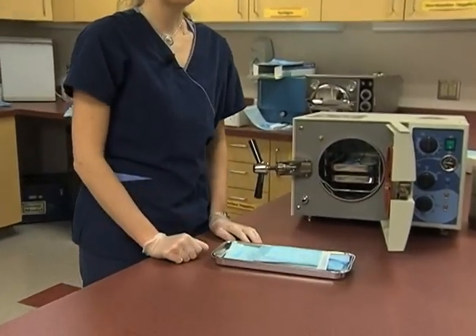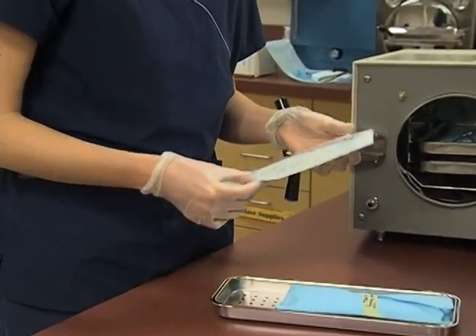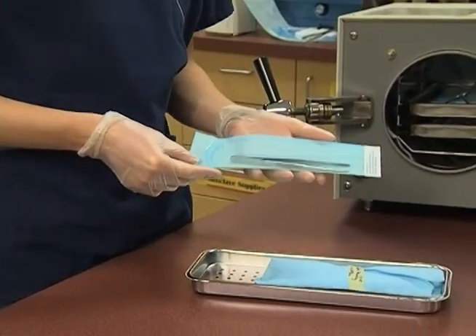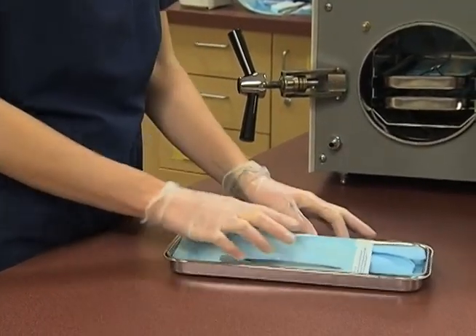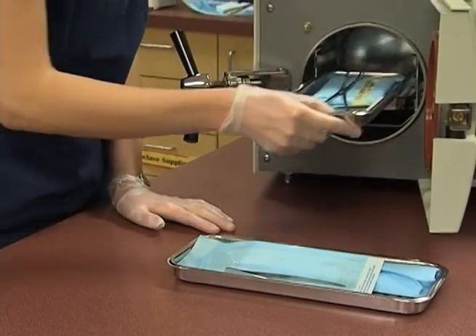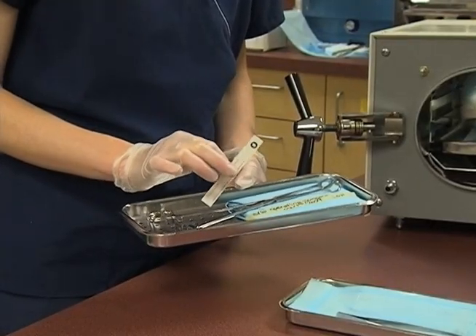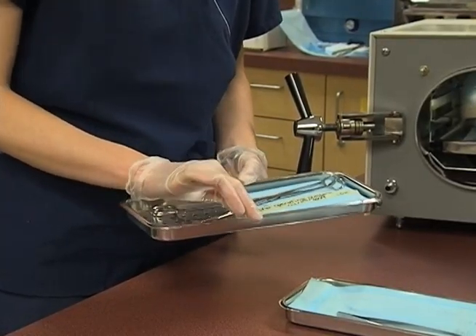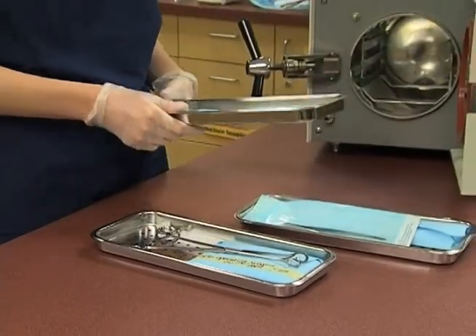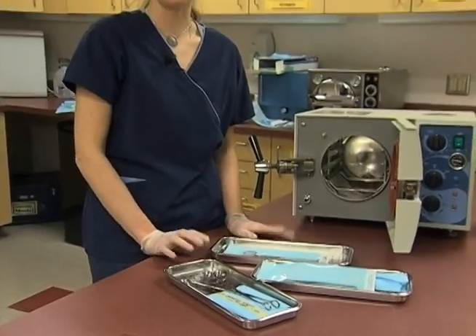Before we put items away, we want to make sure that everything was done properly. We'll be looking to see that the arrows have changed color and that items have been properly autoclaved. Our tape will have changed color on our wrapped items, and our indicator will also have changed color to confirm full sterilization. Then we know that all these items have been sterilized properly and can be put away in the clean drawers where they're kept until used for a procedure.